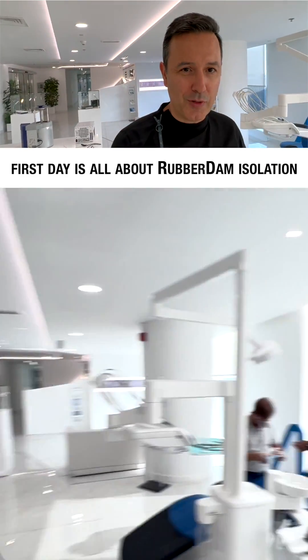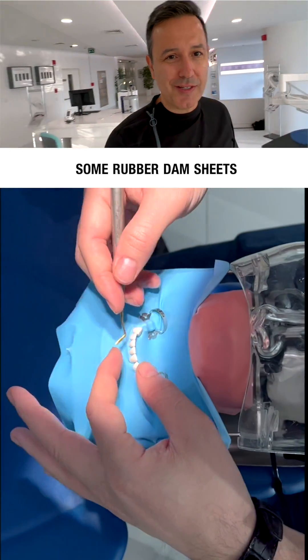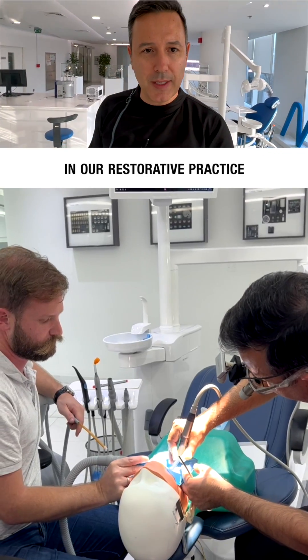The first day is all about rubber dam isolation. And when I say rubber dam, I mean we will consume some rubber dam sheets. We cover all scenarios possible and demonstrate how to efficiently integrate rubber dam in our restorative practice.